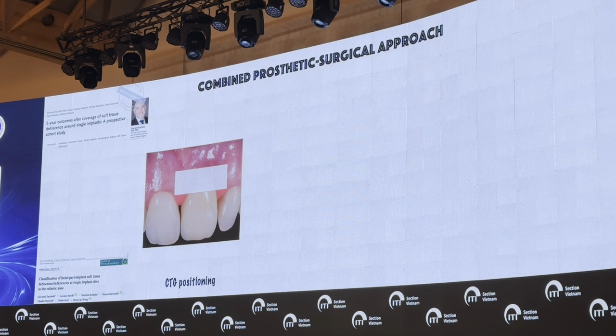If I'm not lucky, the papilla are going to shrink, the buccal aspect of the flap is going to shrink, and the connective tissue graft remains exposed and goes into necrosis. So nothing is going to happen at the end of my surgical procedure. I'm going to have the same baseline situation with some scar because of the flap elevation.